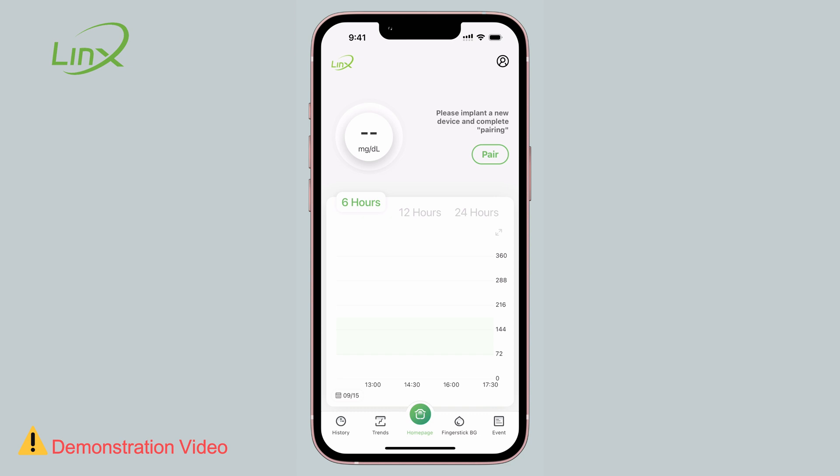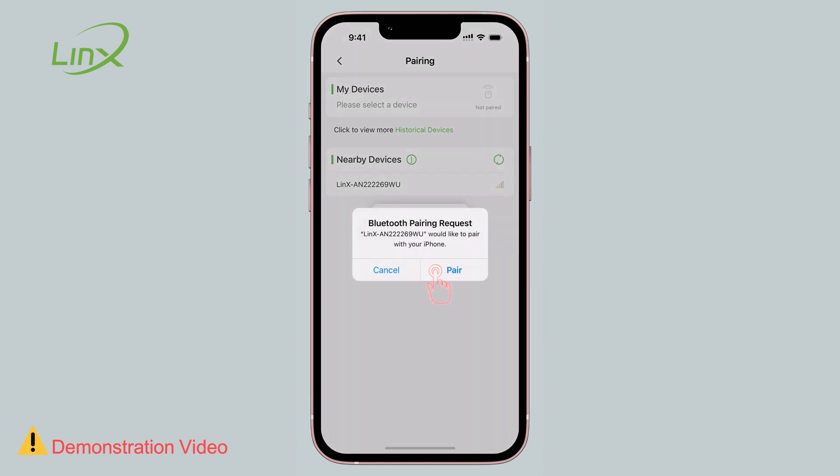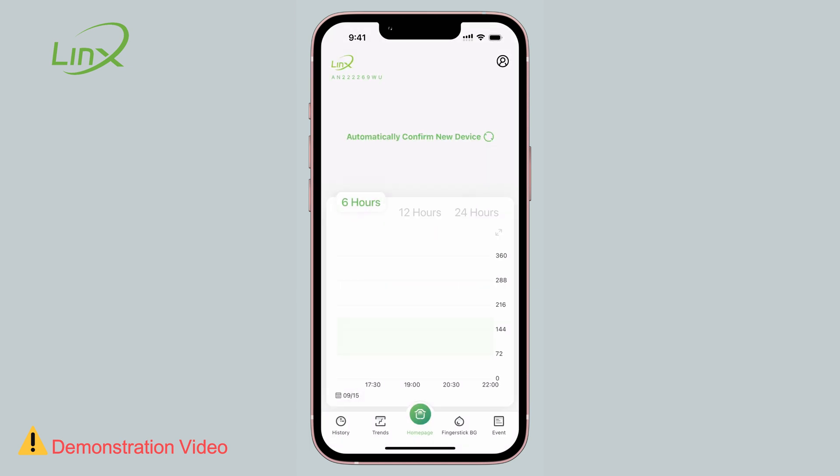Go back to the app and press the pairing icon. The sensor's serial number will appear in the list of nearby devices — select it. It will pair successfully, and the system will enter the warm-up phase. After 60 minutes, the first sensor blood glucose reading will be displayed on the main screen.